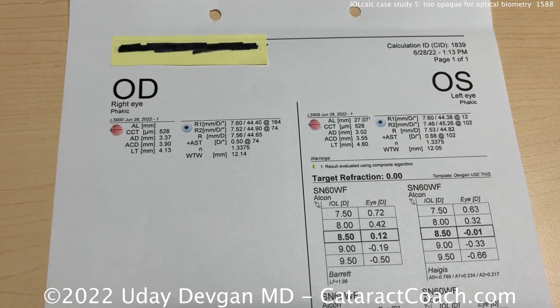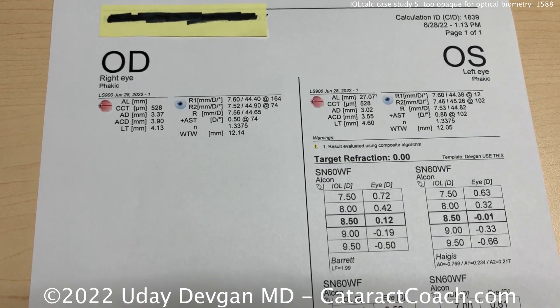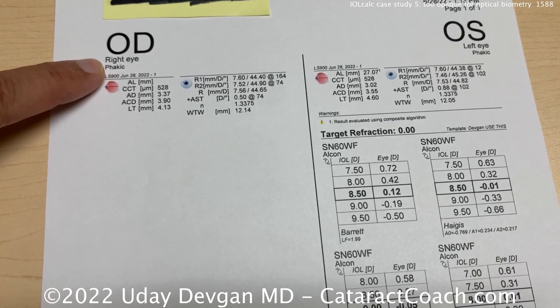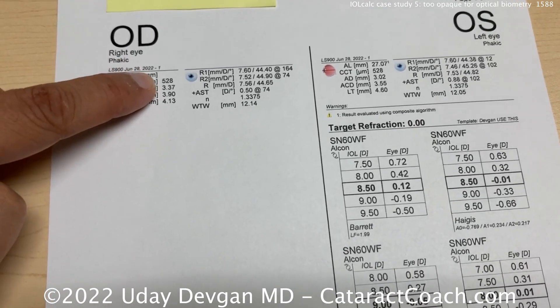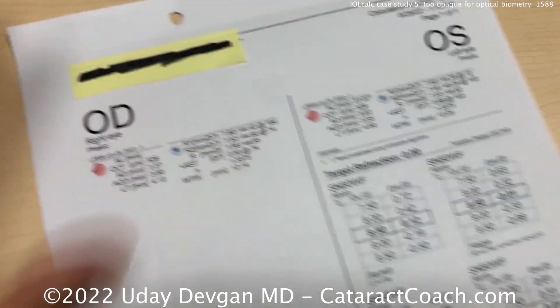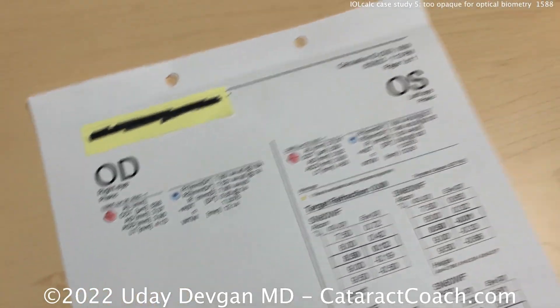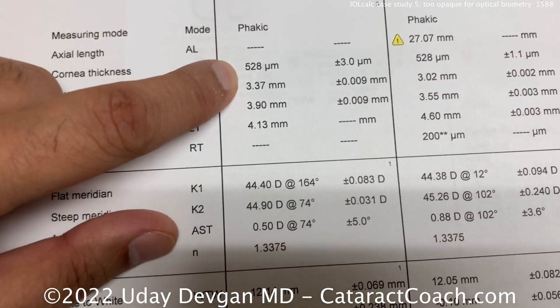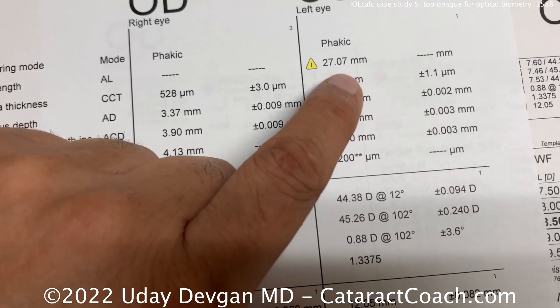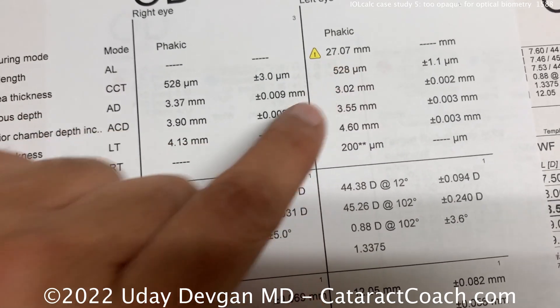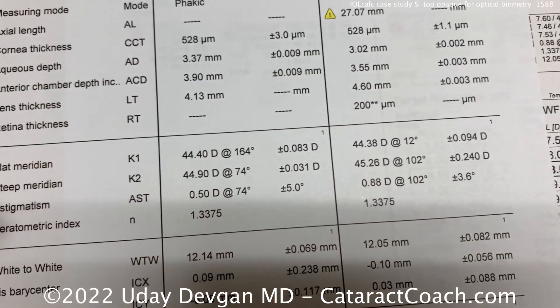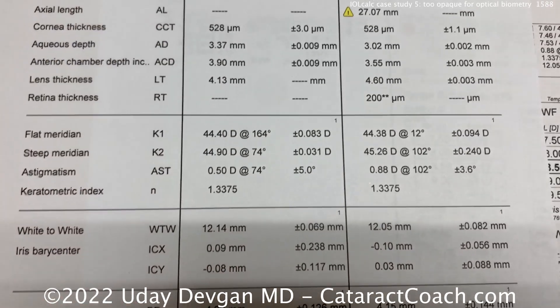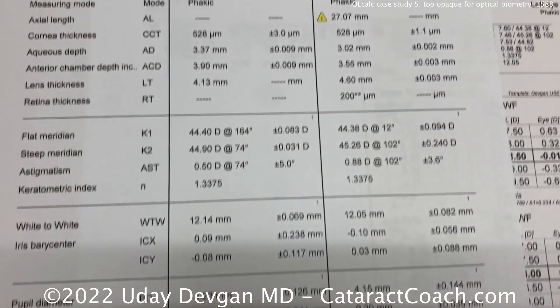Let's look at another patient with a very, very dense cataract — an absolutely white brunescent cataract in the right eye — and unable to get an axial length measurement. Looking at the biometry printout, the machine is unable to read the axial length in the right eye. The left eye is able to get it, but it's not the best data. Everything else looks reasonable. Can't measure retina thickness, barely able to get some lens thickness.